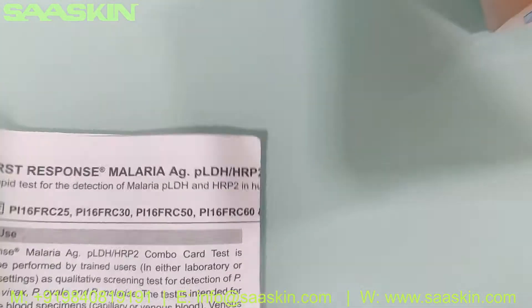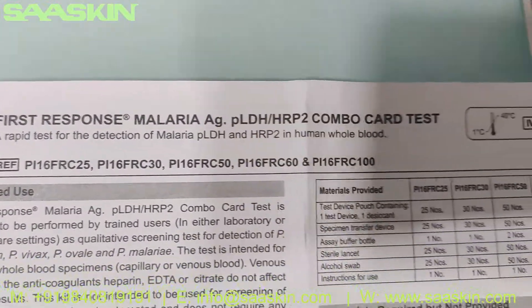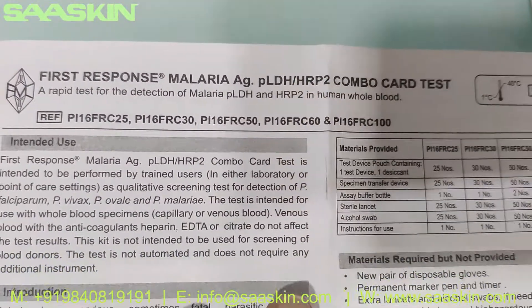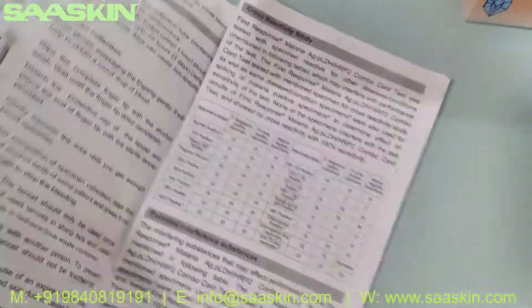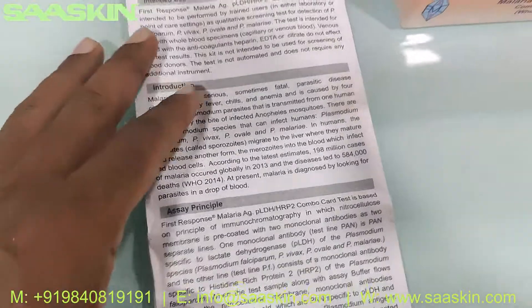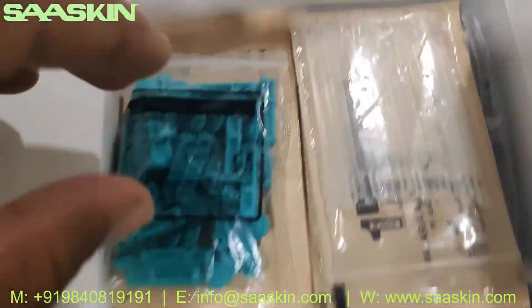You can see the First Response Malaria Antigen Pf Pan Combo Card Test with different reference part numbers for different quantities — it's the same product. This is a WHO pre-qualified product. The IFU brochure gives you complete instructions including the principle behind the test, the sample procedure, testing procedure, and how to interpret the results.